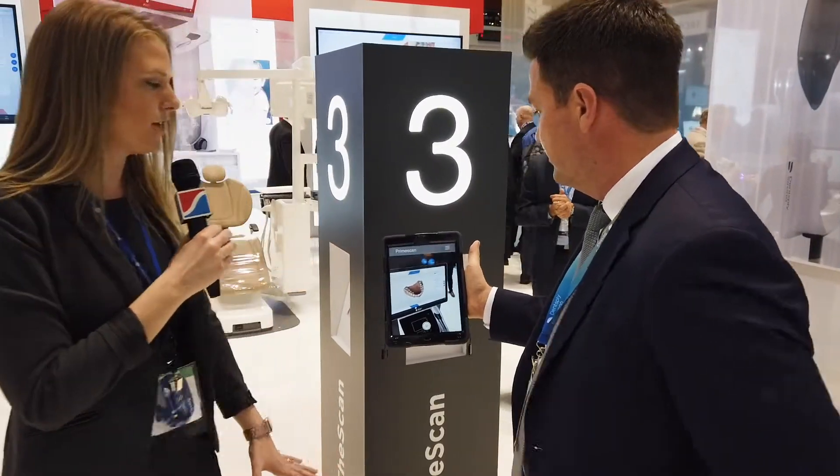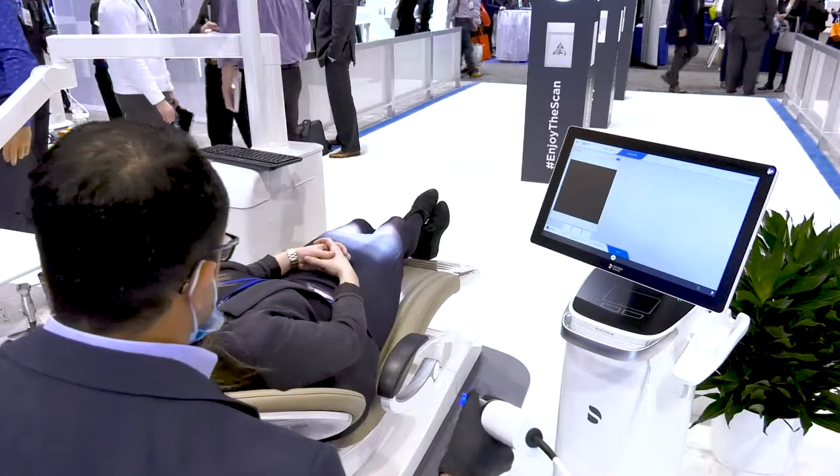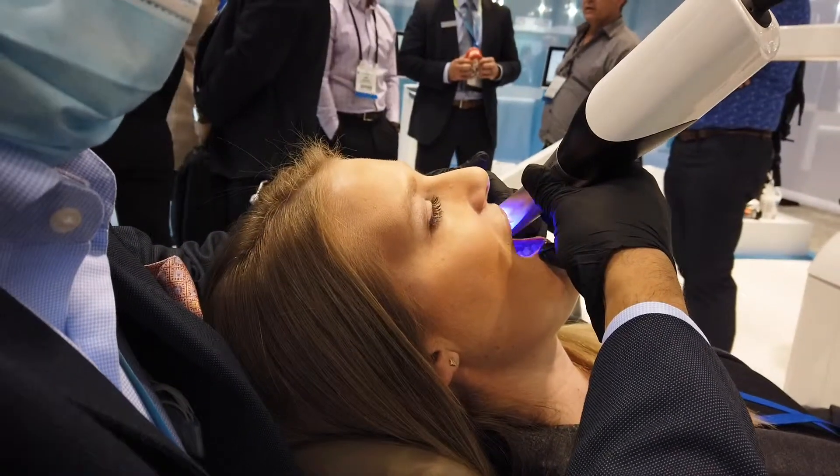There's been so much buzz about this — it's such an exciting product. Can we see how it works? Can you give me a scan? Now we're going to see the PrimeScan in action. Just notice the speed of the camera.